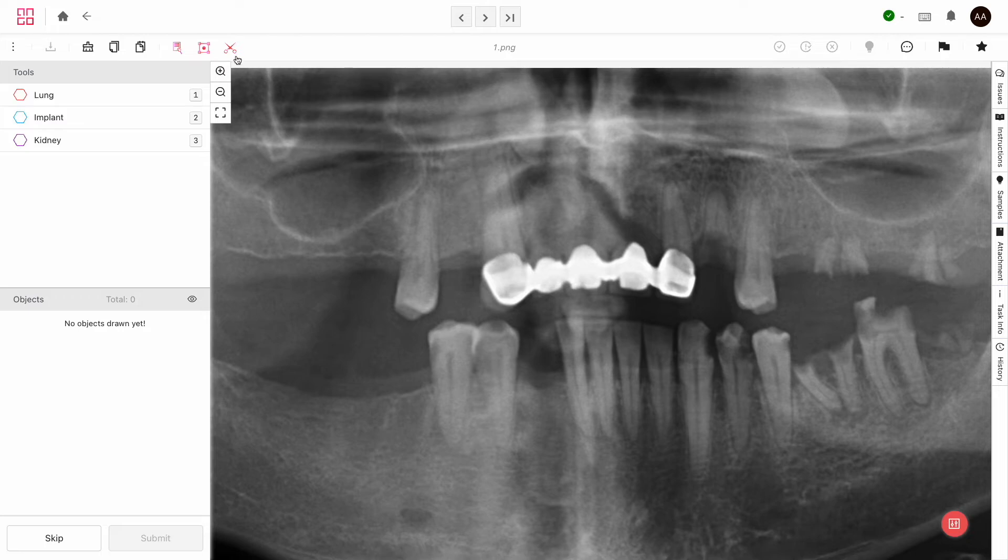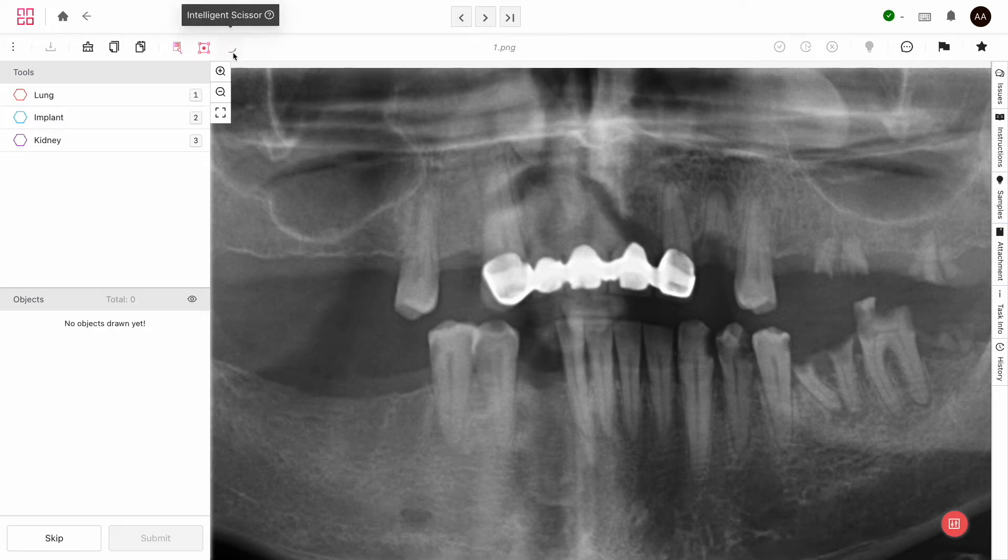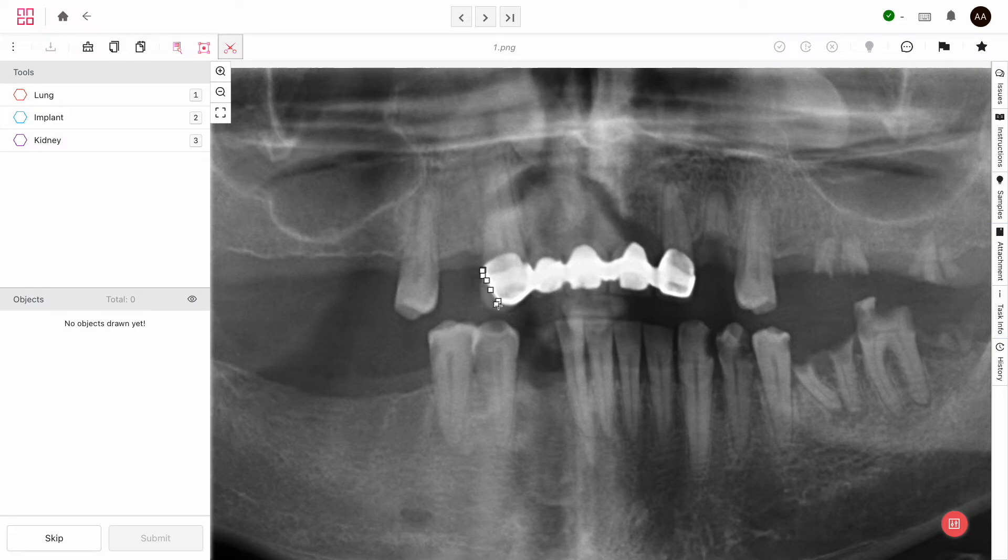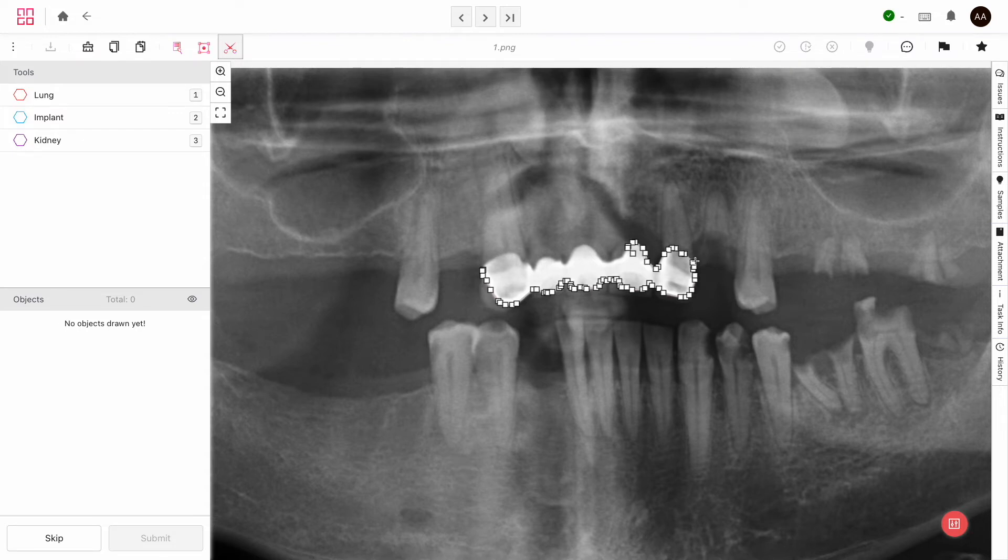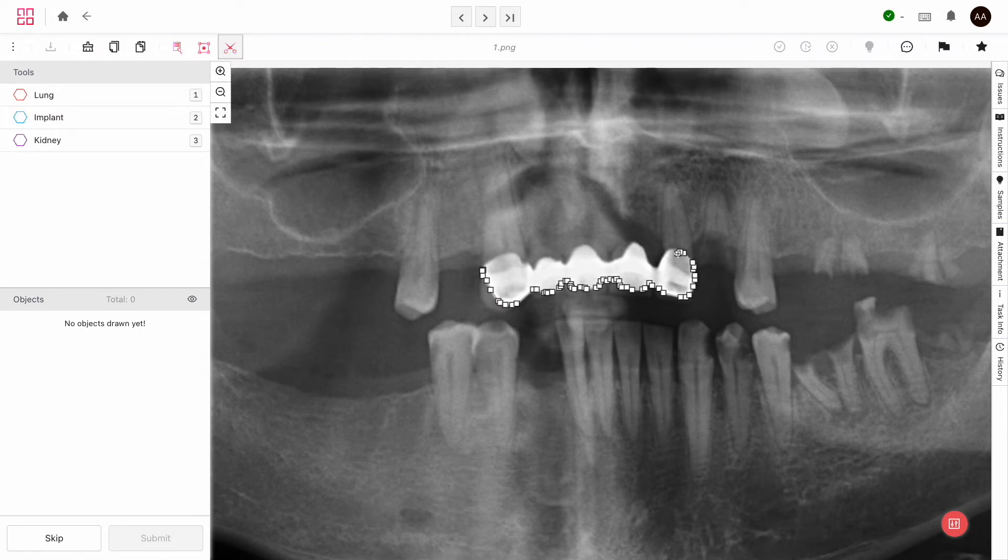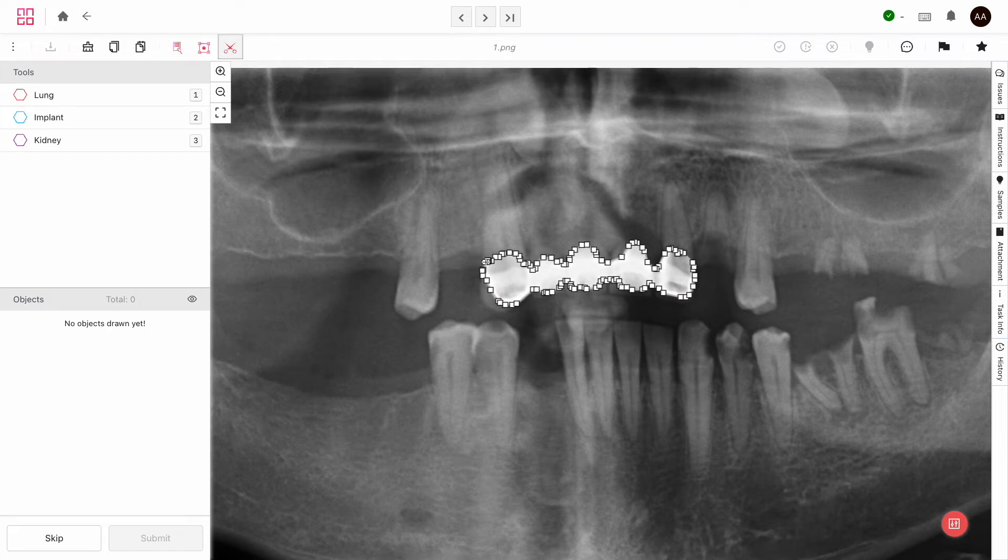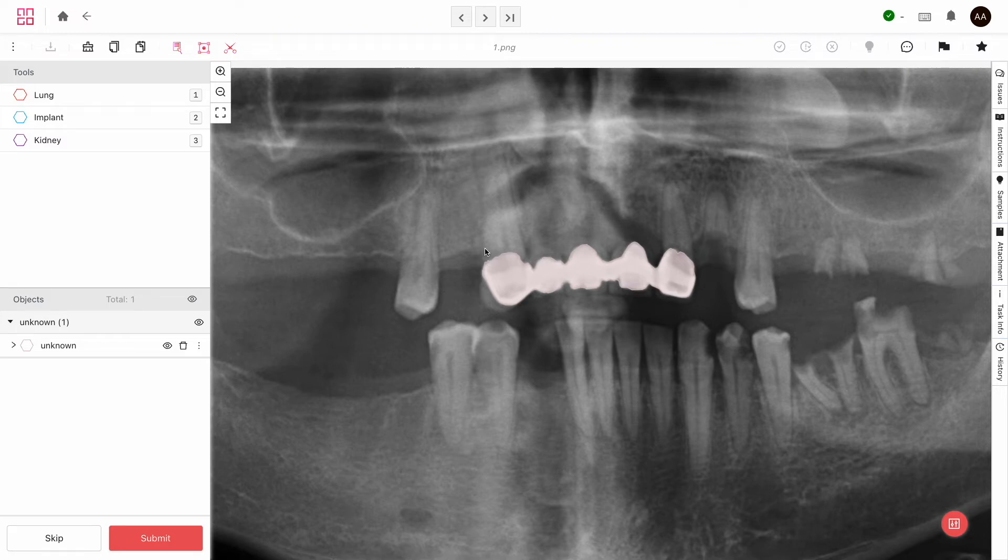For example, just click on the scissors up here, then click on the first anchor point and hover your cursor over the edge of the implant. You don't need to be precise. You'll see that the line will stick to the edge. If you want to specify some anchor points yourself, just left click to add them or right click anywhere to remove the last one. When you're done, click on the initial point or tap on the letter N on your keyboard.